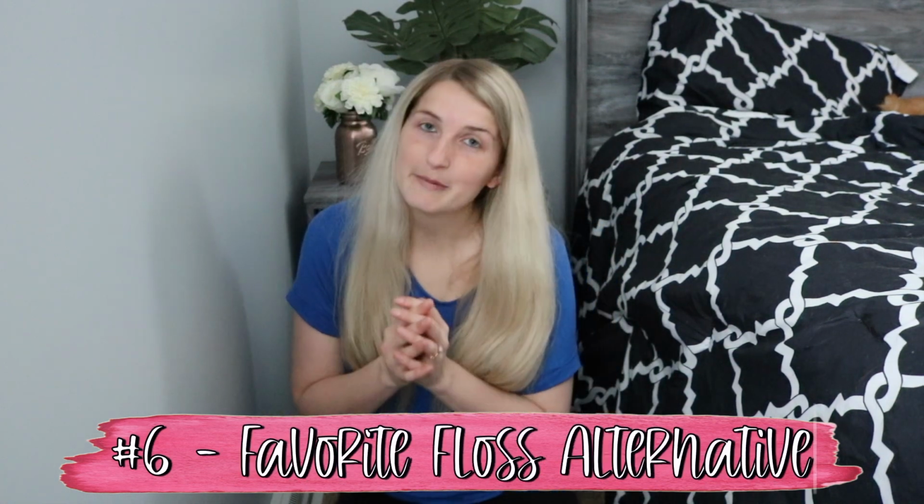The sixth thing on my list is floss alternative. My personal favorite floss alternative is a water pick. I personally don't think that there's anything that's more effective that you can possibly use than floss for your teeth. But with that being said, if you have bridge work or you do have braces, or you're just one of those people who straight up is like, I'm not going to floss ever, period, hands down, not going to happen, then yes, 100,000% I would recommend a water pick for you because I think they're the next best thing.